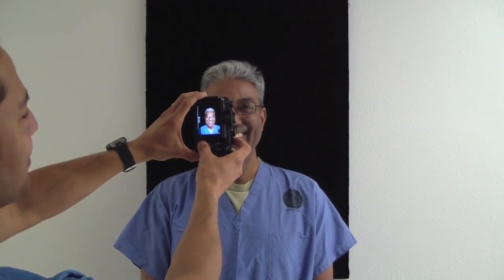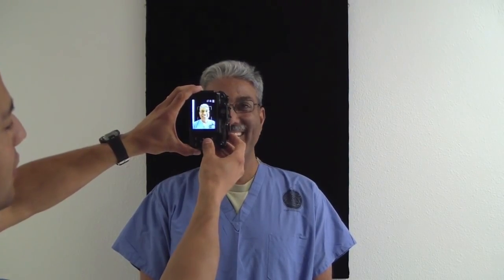Now we'll get the patient to smile as big as you can. It's really tough to get patients in their natural smile. He has a great smile. That's a nice photo. I'm going to get a bigger smile with my macro lens, and we'll do that in the chair. So I'll get you to turn to your left.